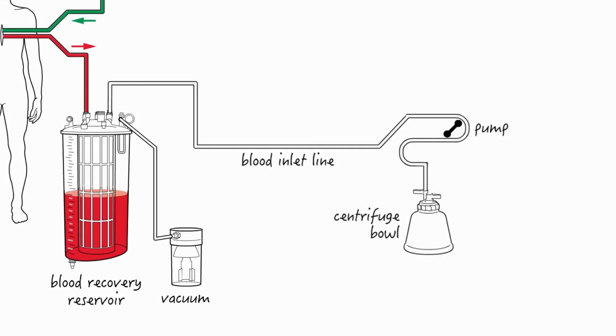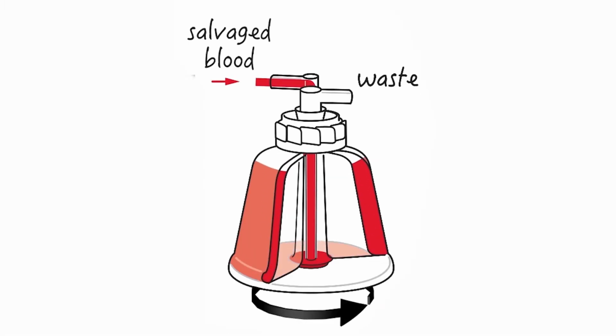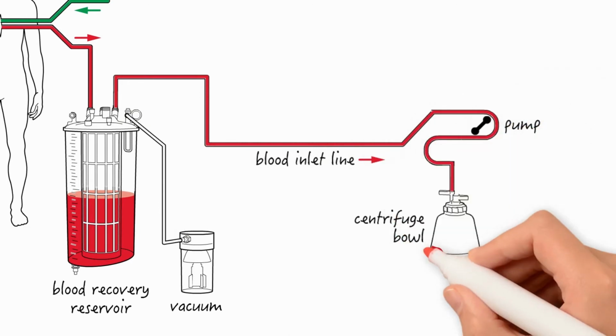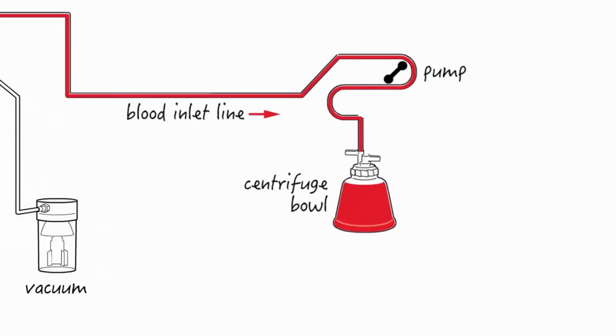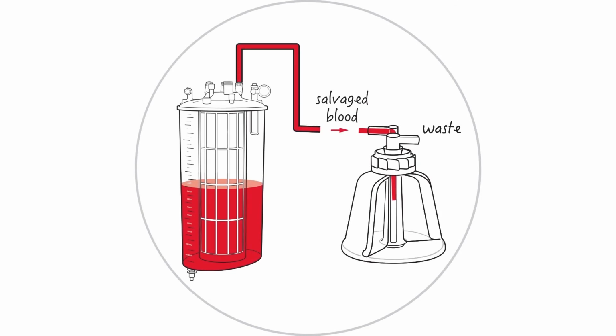Processing happens in three phases: fill, wash, and empty. Both fill and wash phases utilize centrifugal force to separate the blood components. In the Xtra, this is 5,600 RPM. Fill refers to filling the centrifuge bowl from the collection reservoir. The fill phase does two very important things. It concentrates the red blood cells and removes supernatant.